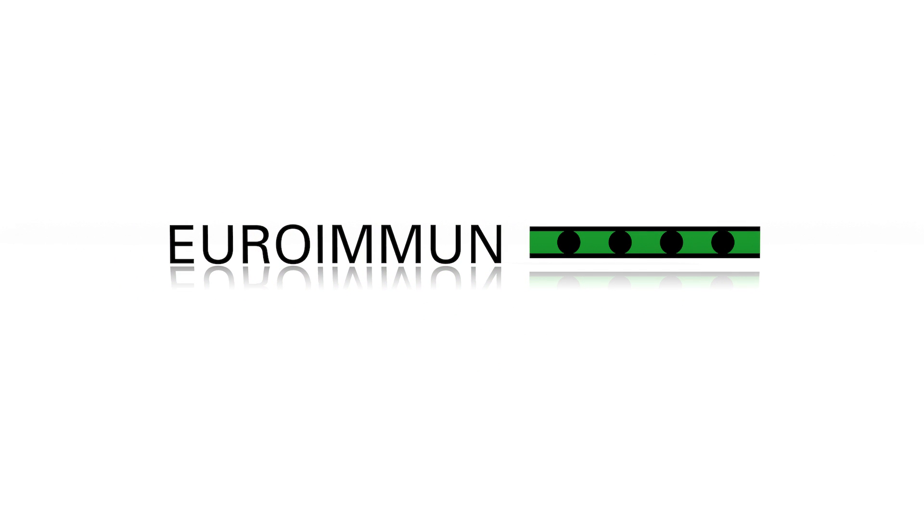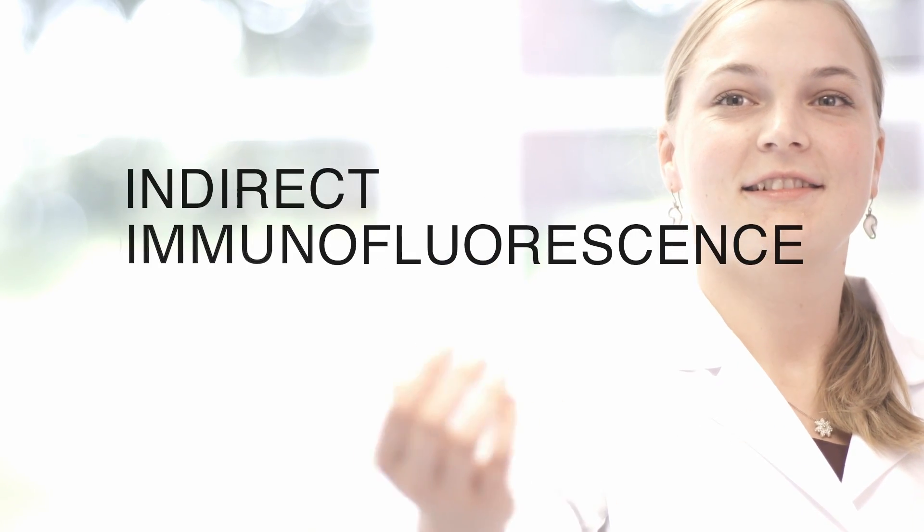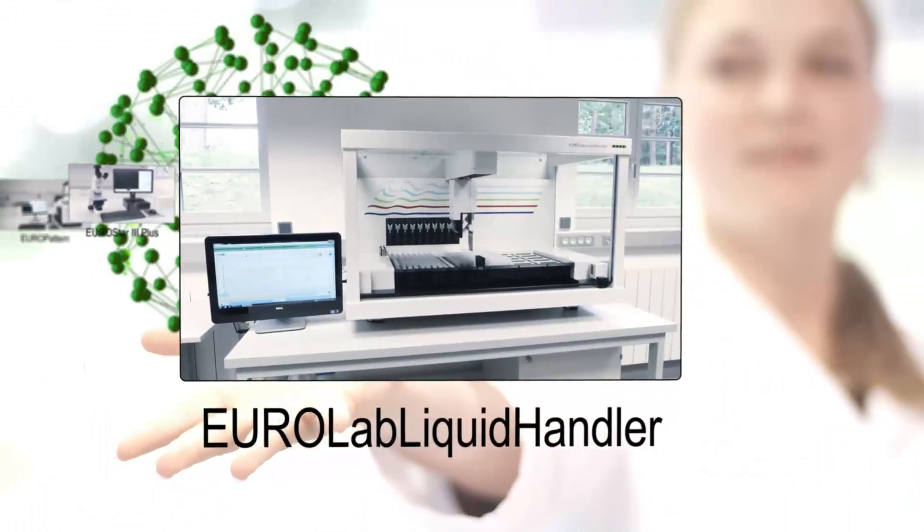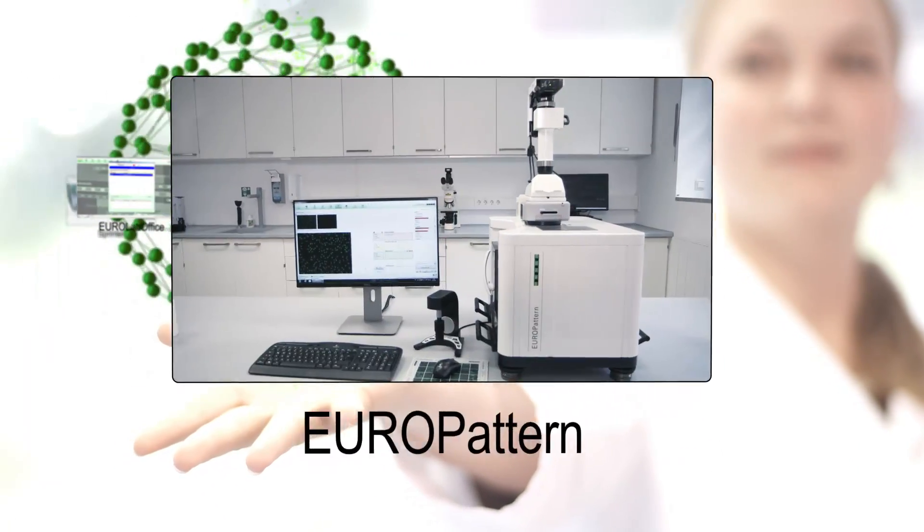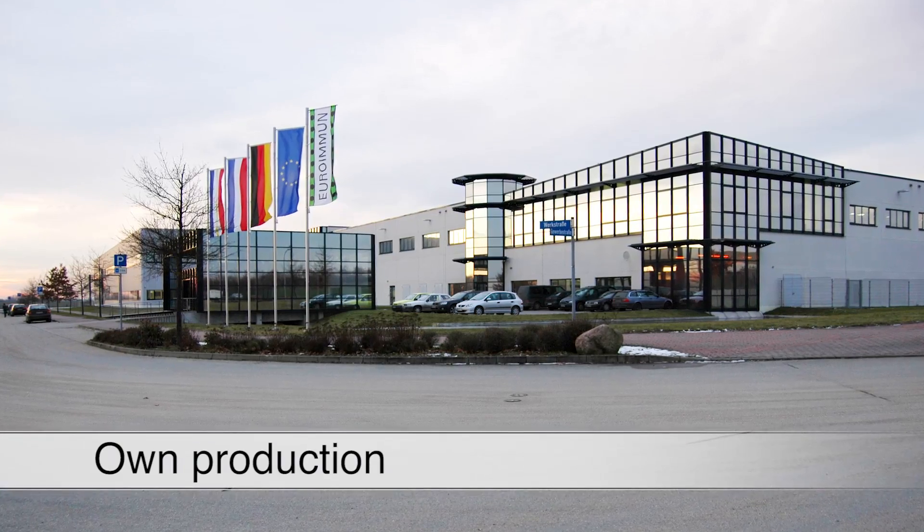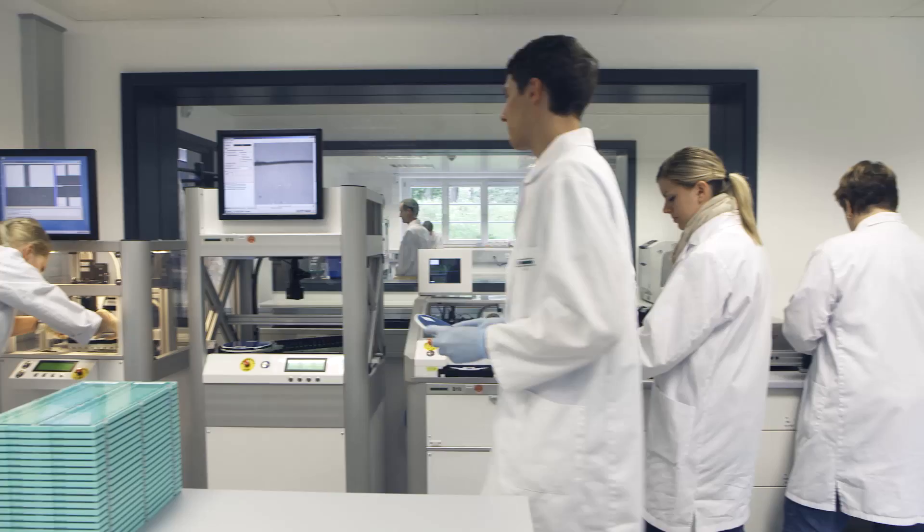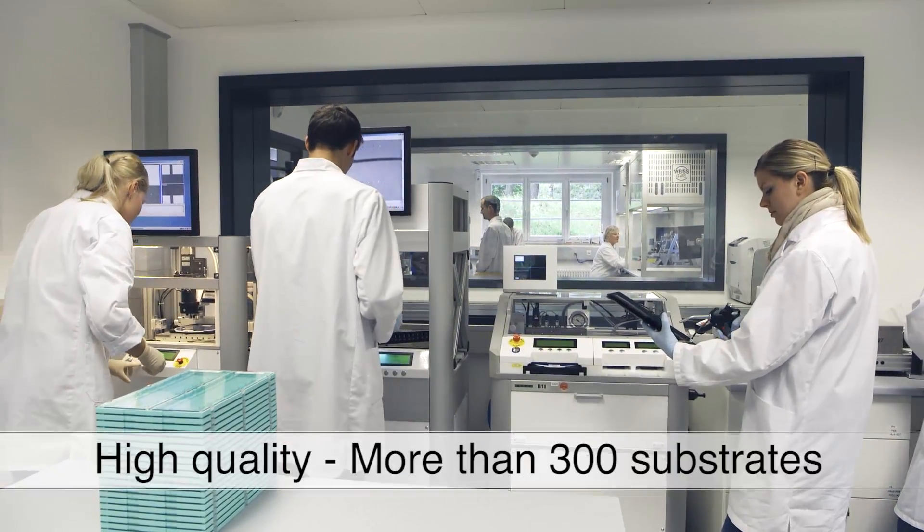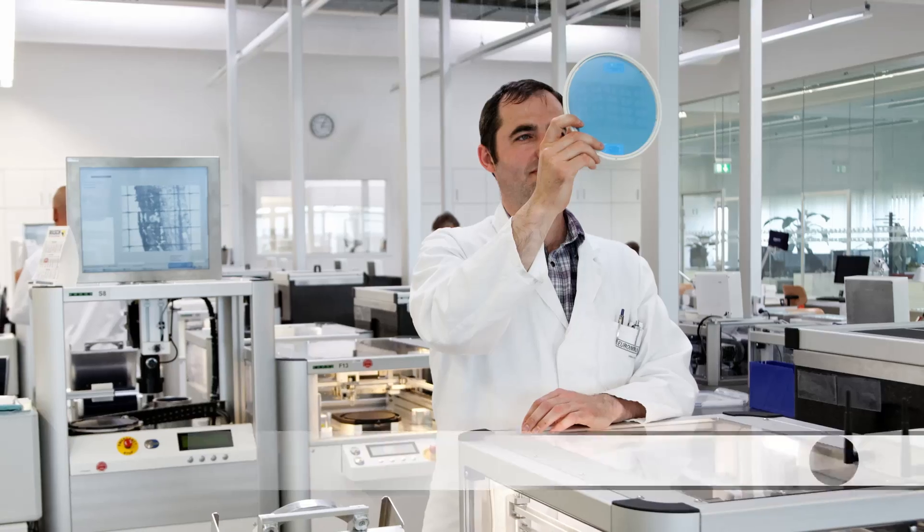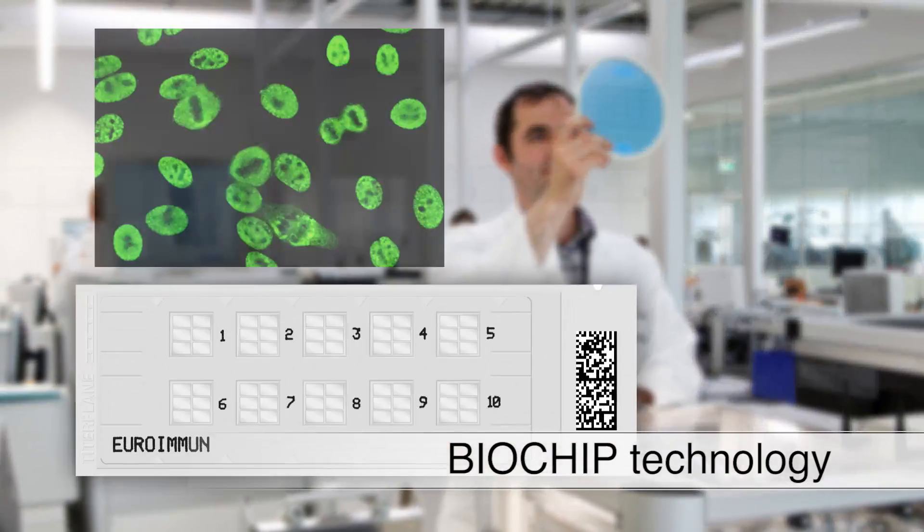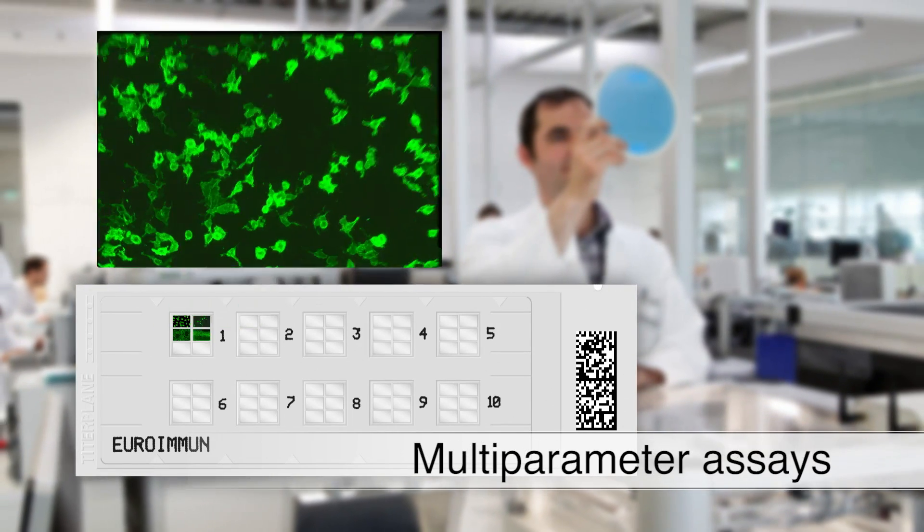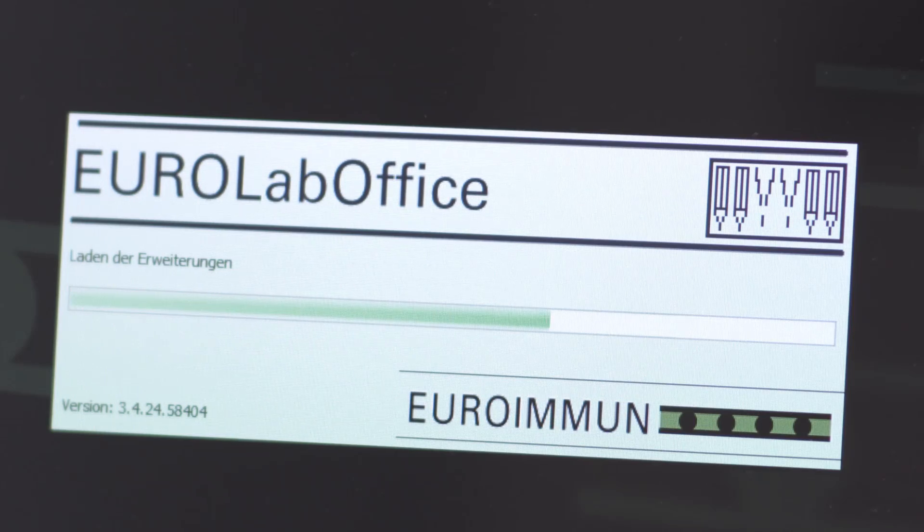Euroimmune is the leading manufacturer of innovative diagnostic products for indirect immunofluorescence for the detection of autoimmune diseases worldwide. Our own in-house production and a broad spectrum of around 300 different substrates constitute the basis for excellent diagnostic products and, due to the unique biochip technology, also for efficient multi-parametric analyses.